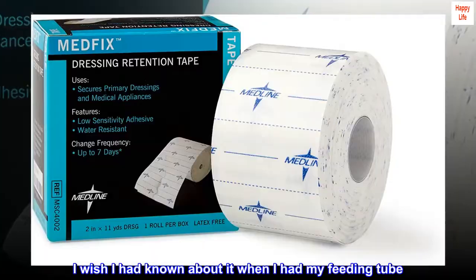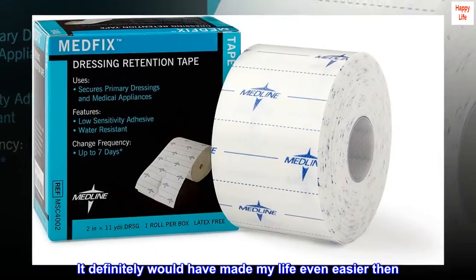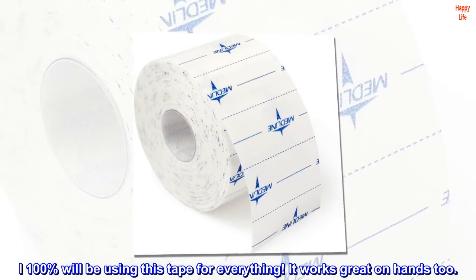I wish I had known about it when I had my feeding tube — it definitely would have made my life even easier then. I 100% will be using this tape for everything.